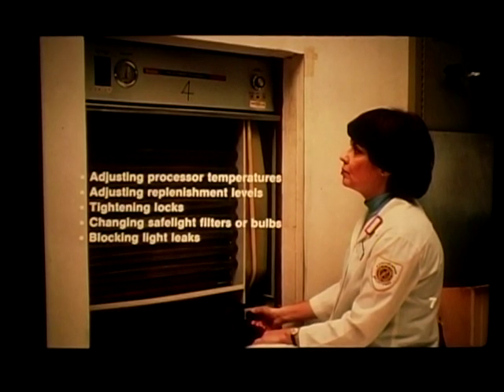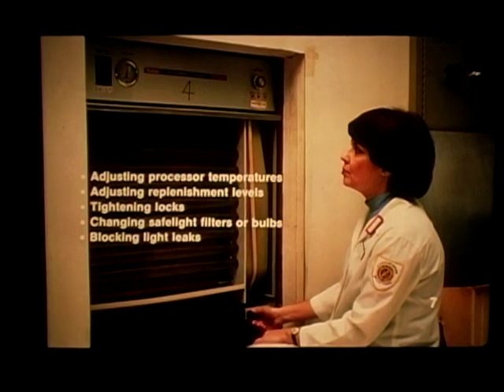Number 7. Some minor adjustments can be made by the radiographer if proper training has been provided and if the authority to do so has been granted. One individual in each radiology facility should take a course in automatic processors and be familiar with operating, cleaning, monitoring, and adjusting the processor. This is especially helpful in busy departments with only one processor or in rural areas where service personnel are often located hours away. Minor adjustments that can be made by the radiographer include adjusting processor temperatures and replenishment levels, tightening locks, changing safelight filters or bulbs, and blocking light leaks in the darkroom.